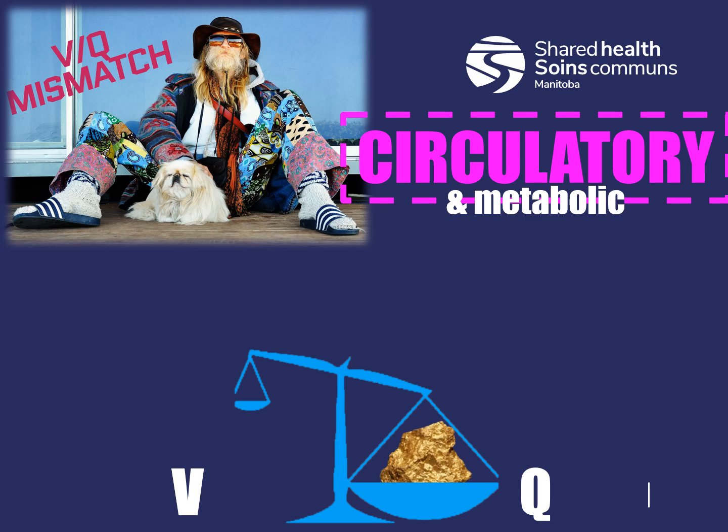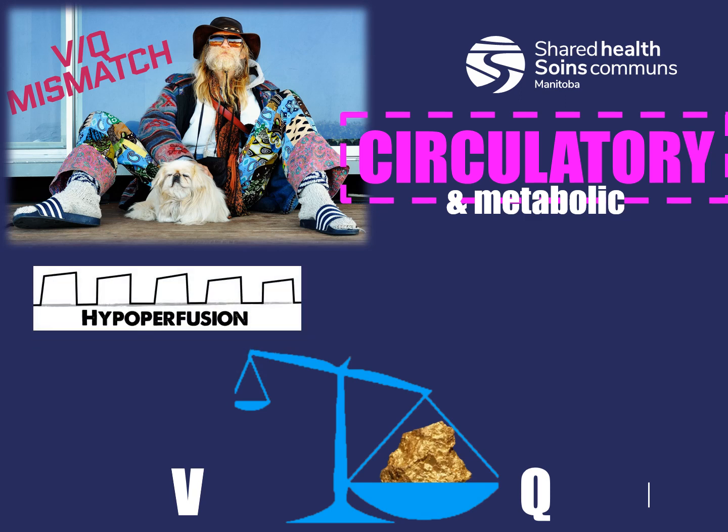Circulatory metabolic VQ mismatch. So there's a change in the Q, or perfusion, while the V, ventilation, remains normal. Assuming a normal respiratory rate and respiratory status, changes in end tidal CO2 levels can indicate a possible circulatory and/or metabolic cause. So there's trauma, hypovolemic shock. This is decreased perfusion. So there's decreased end tidal CO2, and this can also be noted in other forms of shock, such as cardiogenic.